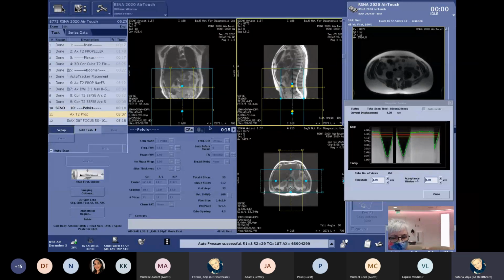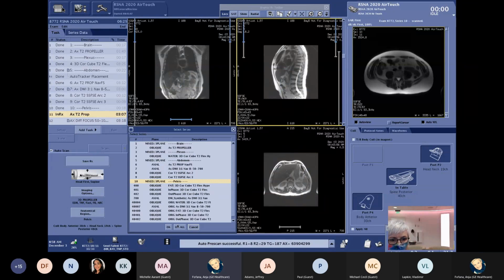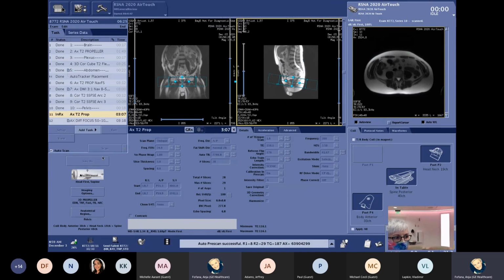So I will do one more sequence in the prostate. Therefore, I will use the localizer from the pelvis, and then just prescribe slices here over his prostate, and I will use again the PROPELLER technique. We will do 3 mm slice thickness, and we have an in-plane resolution of 0.8 by 0.8. And as you can see, plenty of coverage with the air coils. No need for me to go inside the scan room and change the coil setup.